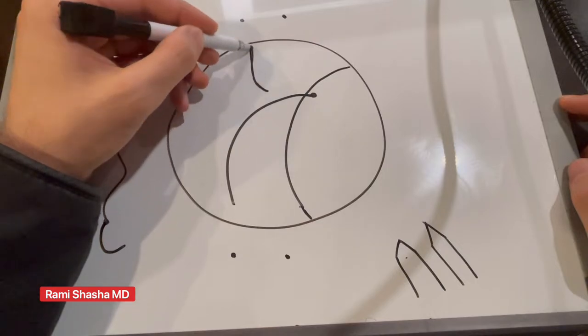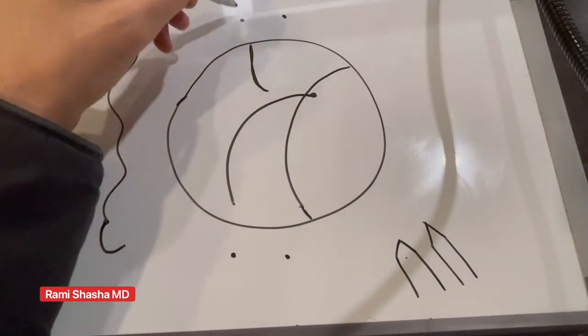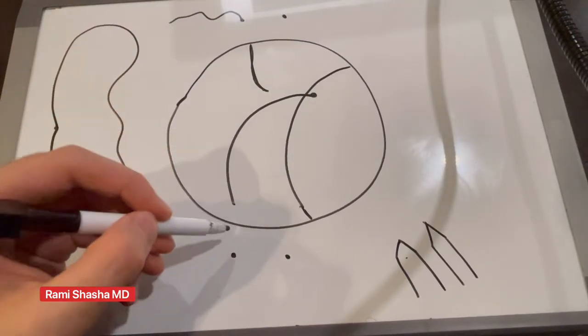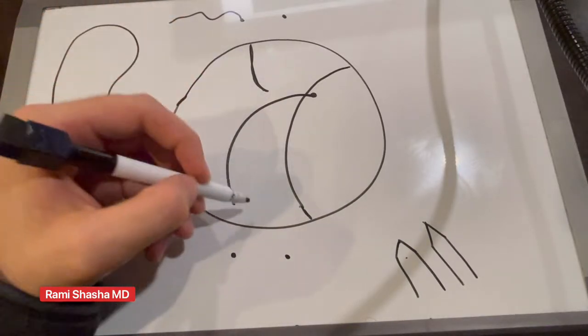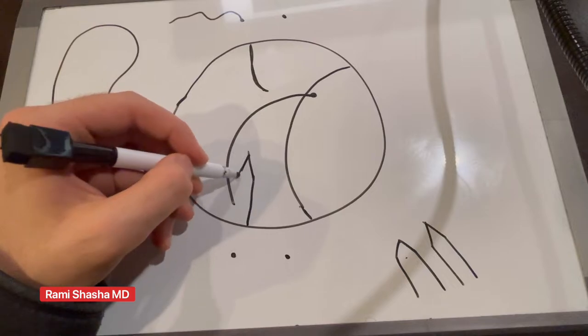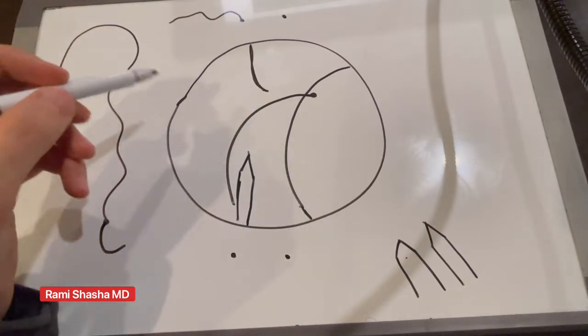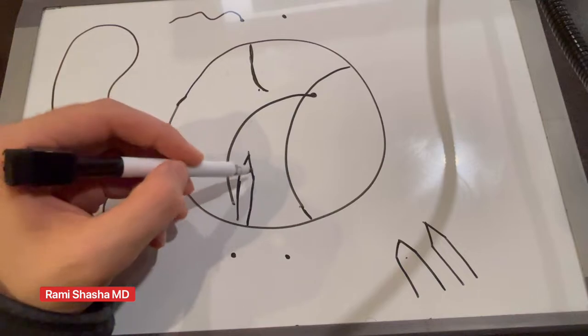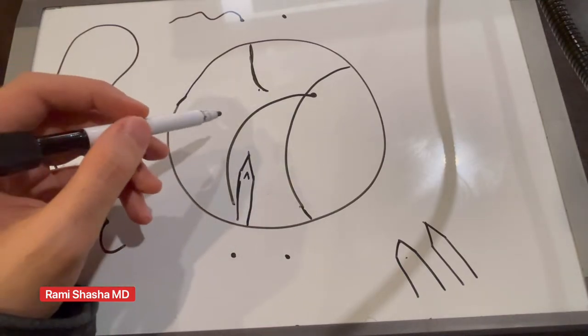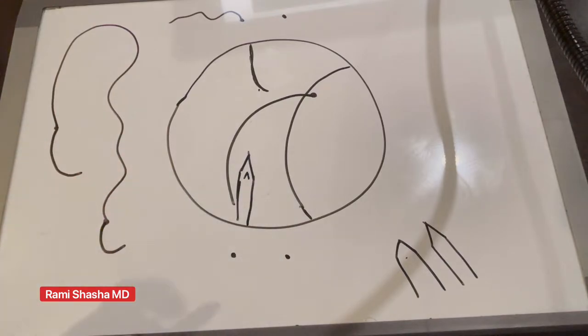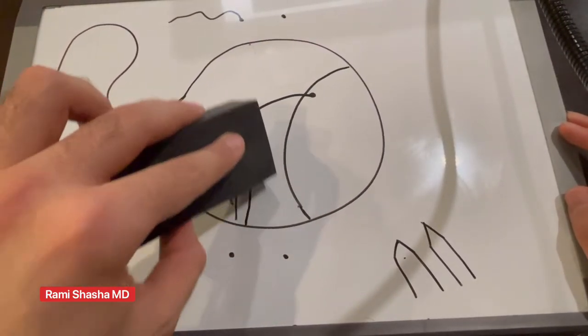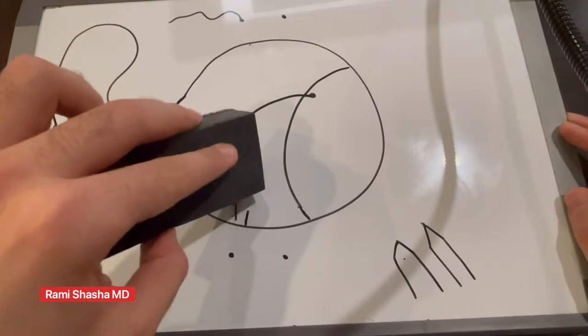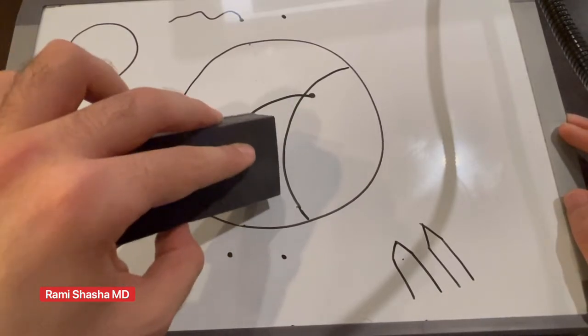Here's the actual needle, this is the suture. What you're going to do is pass the 27 gauge needle across, then pass the needle into the lumen of the 27 gauge needle and externalize it. You're basically going to pull the 27 gauge needle out once you've put the suture through the lumen.